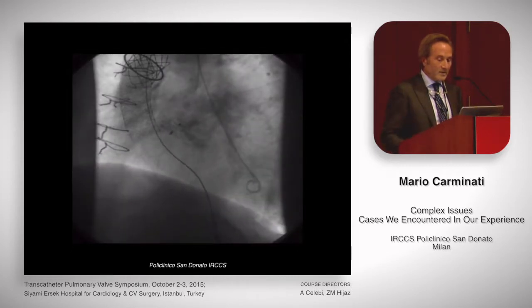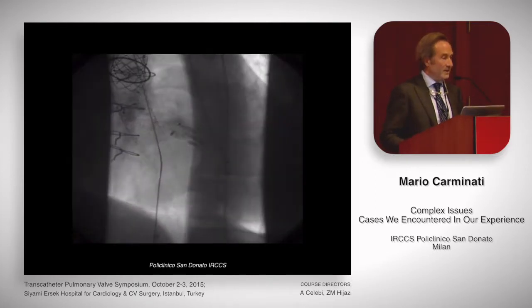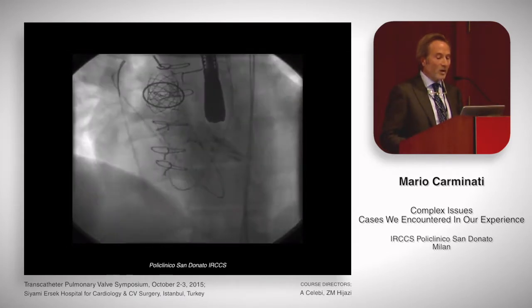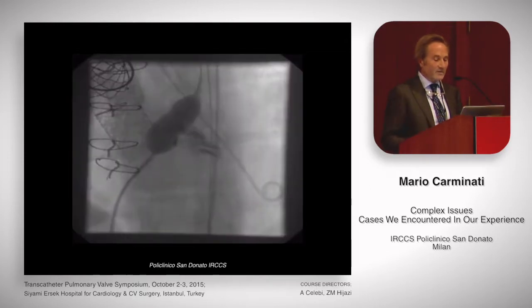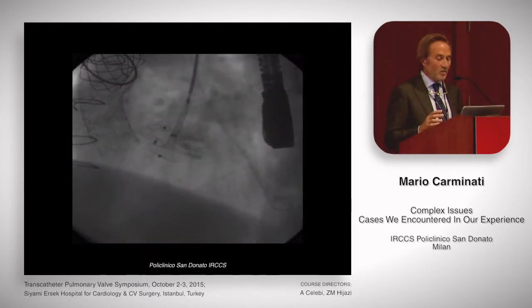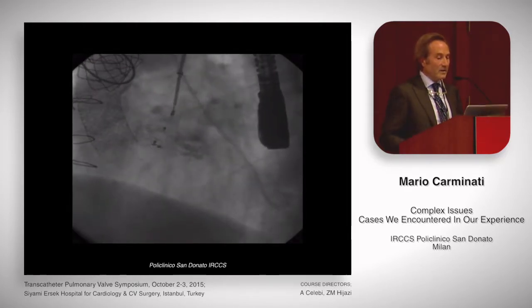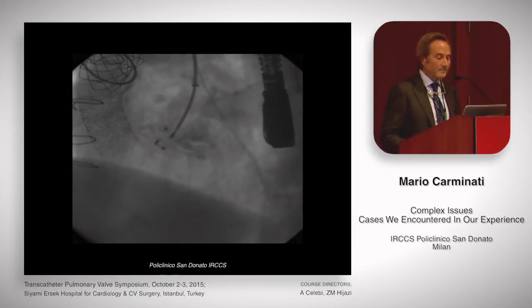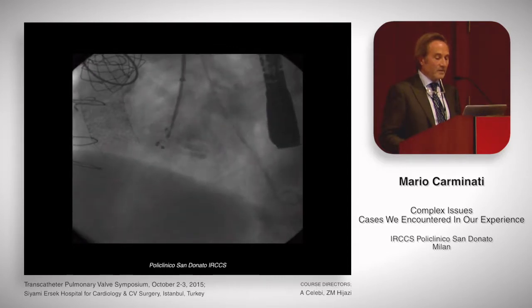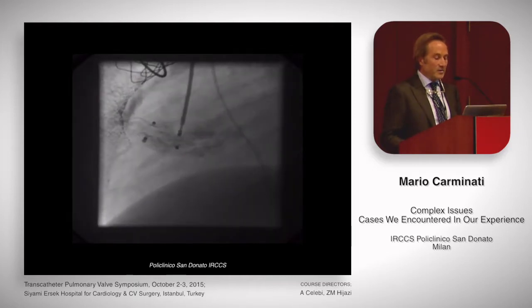You see the long metal tube. The LV angiogram showed a very large residual VSD again. So what we decided to do during that catheterization was to try to close the residual VSD. We entered the VSD from the left side, established an arteriovenous loop. This is a balloon sizing across the VSD. Then we implanted a muscular VSD occluder directly from the artery, from the aorta. You see the device still attached to the delivery cable, and a check angiogram to verify the good position of the device.